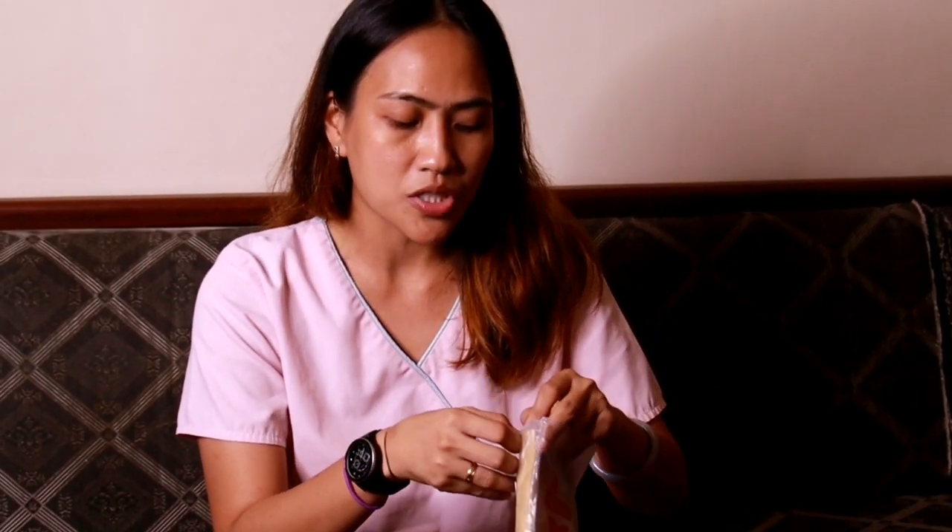I already searched far and wide but this is not available locally, so I tried to purchase it from Shopee. The product is the membrane and ring — also called the diaphragm — for my Littmann Classic II adult stethoscope.